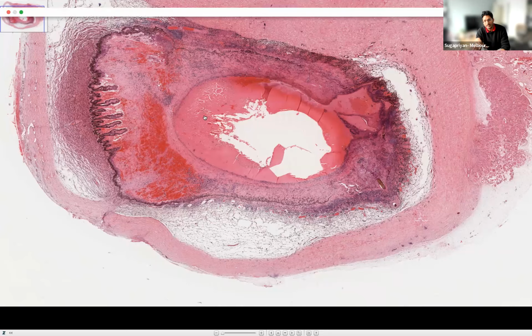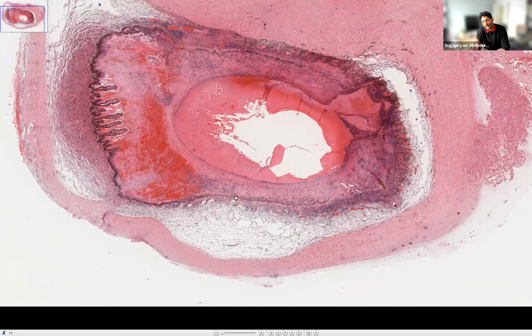But if I go back to here, and just when you're on there, you said the RPE, you showed us how it looked or where the original line could be. But again, if you're looking at this with an untrained eye, how do you start to look for an RPE layer, which just looks like a line of pigment? Yeah. Stay at low power. So yeah, second question first. I was going to say you can kind of see it through here. Yep, at low power. And so that's going to be choroid and that's going to be RPE.